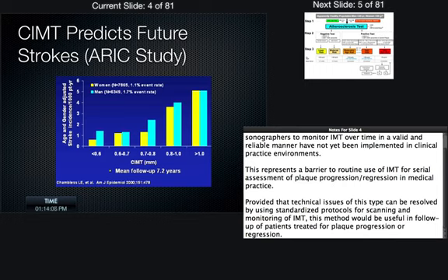And so this is something that would be potentially useful, especially in primary care, now that ultrasound is suddenly becoming very ubiquitous and it's everywhere. And as that machine evolves into a much smaller, cheaper handheld device, which is happening as we speak, this is something that, especially if you're in primary care or cardiology, you may find yourself really using quite a bit.